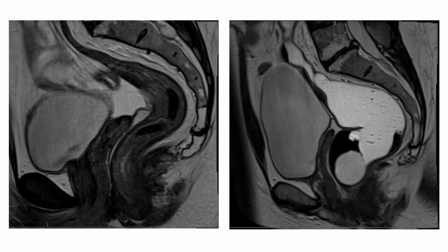This was confirmed with a high-resolution rectosigmoid MRI protocol. Images seen highlight the lesion extending into the muscularis. The patient declined ongoing hormonal suppression and desired definitive surgical management with excision.